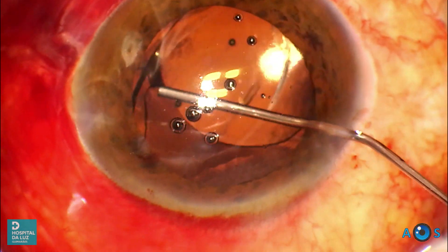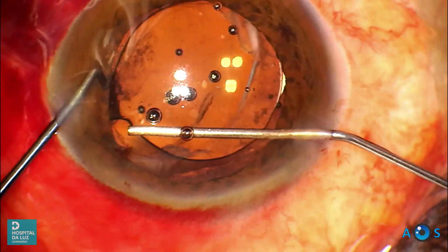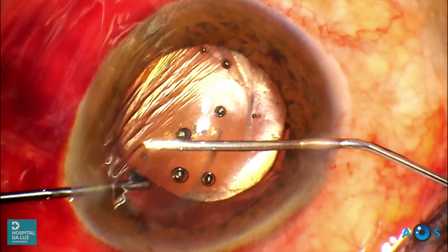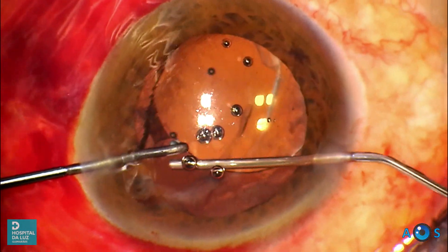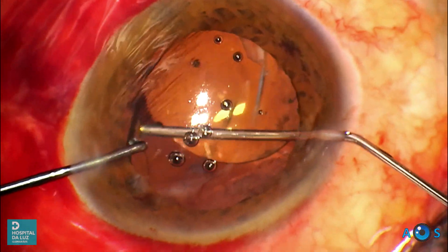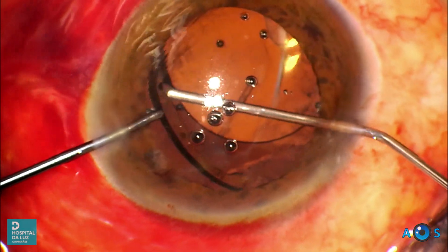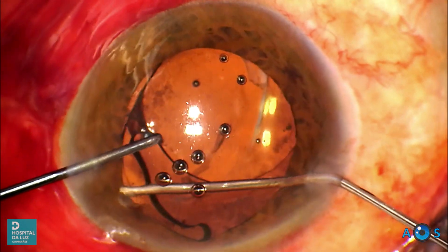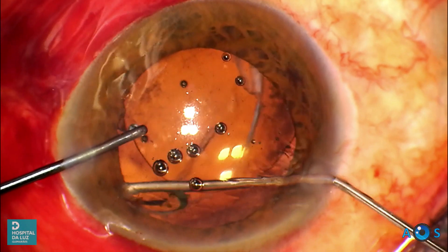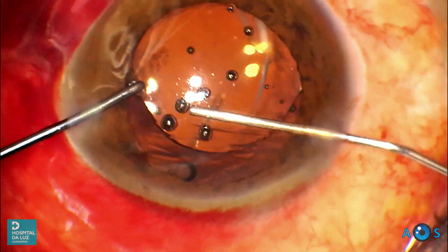Now we will use a chopper as a second instrument in order to move the nasal haptic in a controlled maneuver inside the capsular bag. And there it goes.